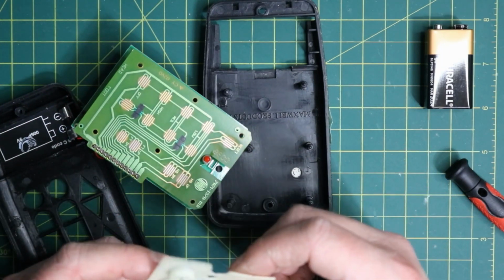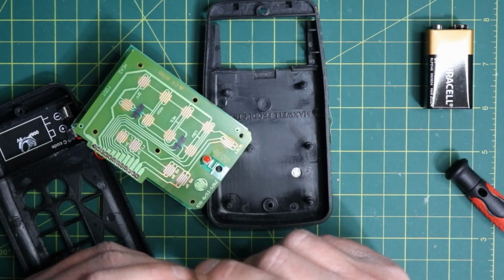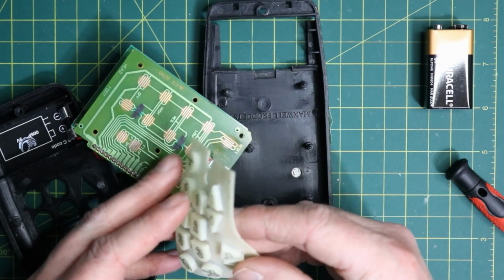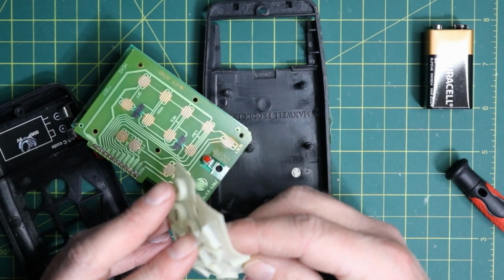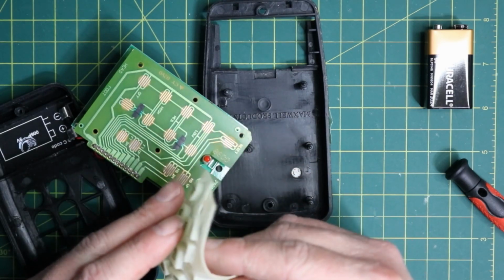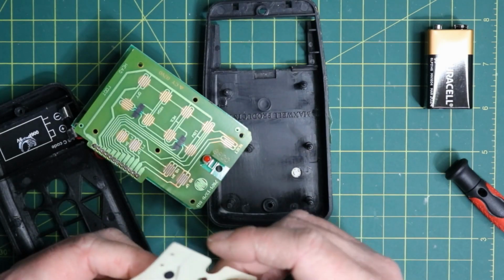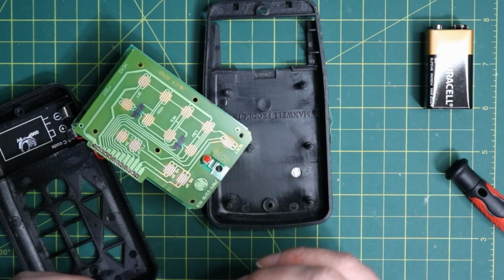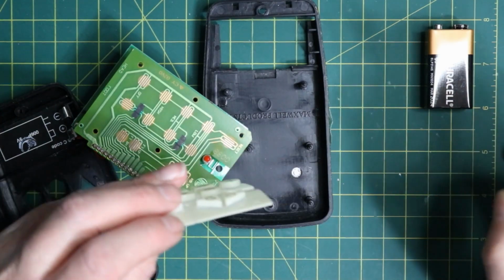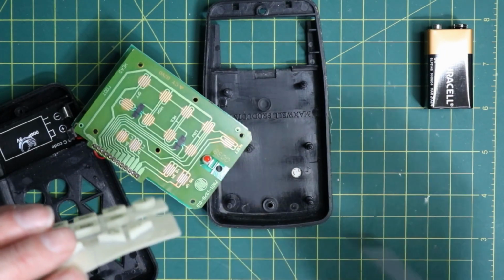We're going to inspect the inlay here, but I just want to point out one thing on these pads. Around the outside of these molds, they have a tendency to rip and tear at times. So if I zoom in closer here, you'll be able to see exactly what I mean. It's not much, but it's enough to make it so the unit won't function correctly over time, or this is how we lose buttons.